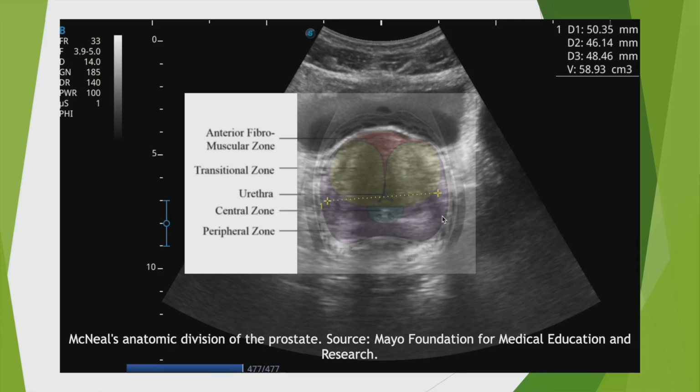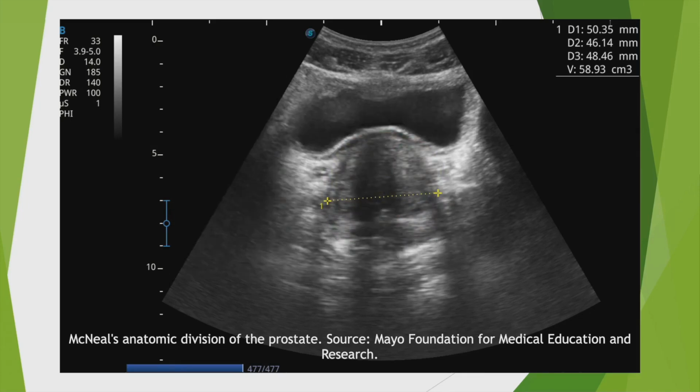This is the area of particular interest to us in the search for prostate cancer, even though ultrasound is, in my opinion, a very poor tool for diagnosing prostate cancer. So, let's pull back the cover just a little to see.